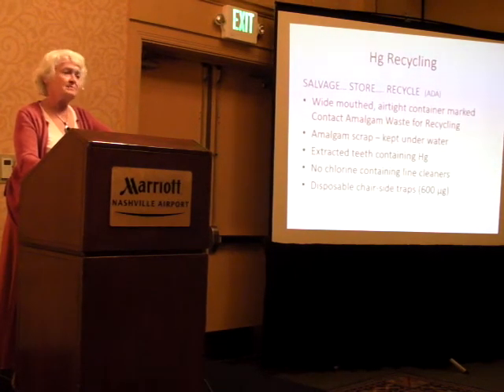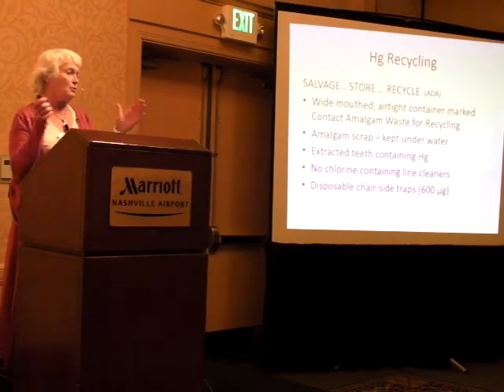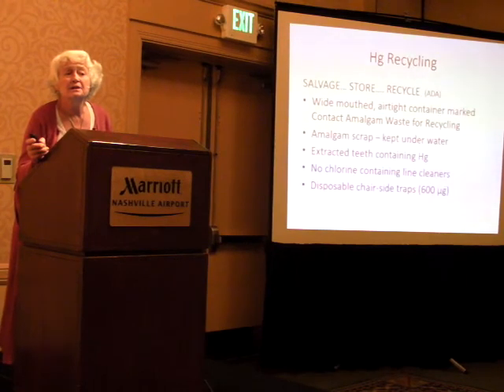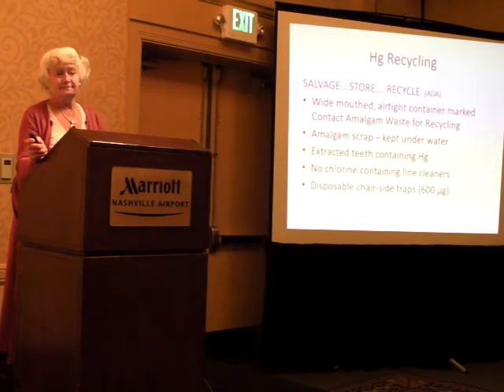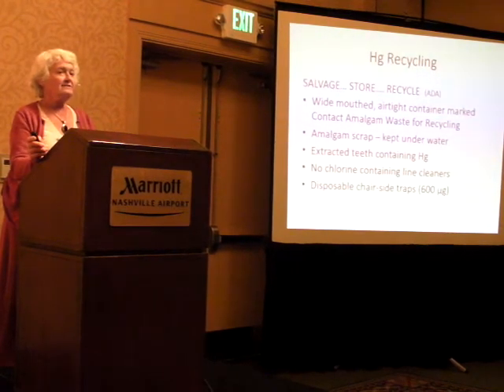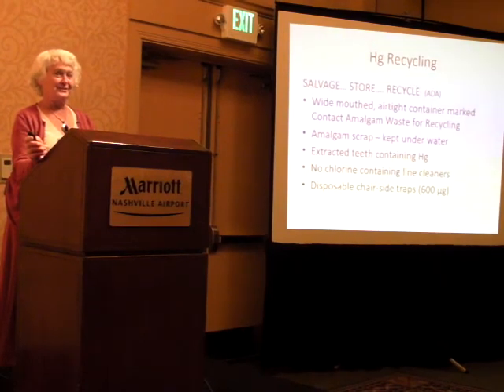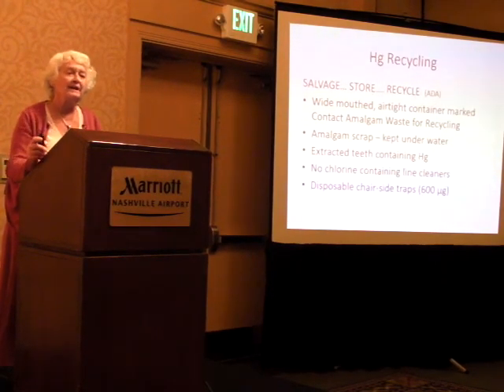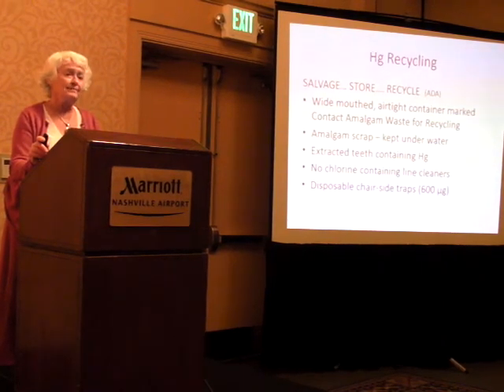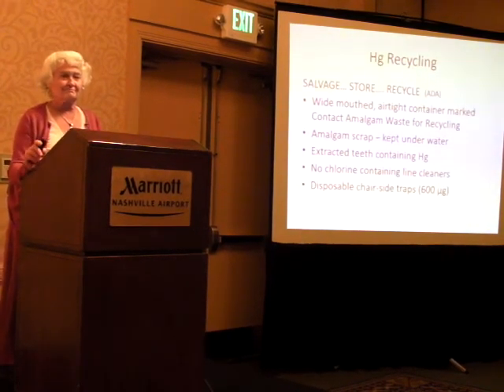And the other systems have different ways they'll come in and actually take the whole unit. Some of them will be every 2 years. Yes, they do. It is volume, but we tried that, and they actually started contacting us: you have not replaced your filter. We had a spare one anyway, but they do actually keep track of those records. Just so you know.